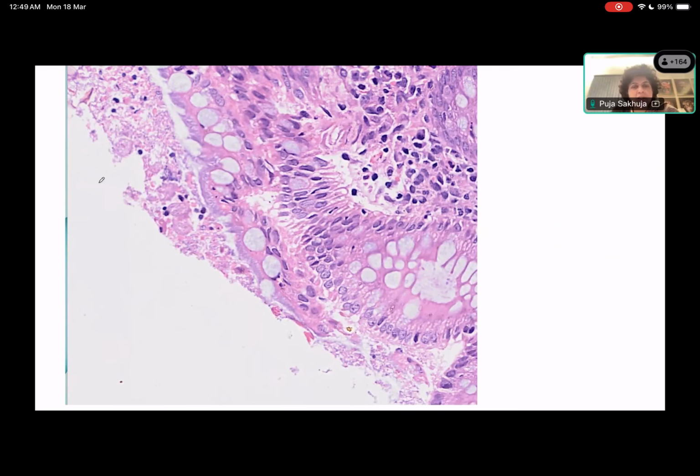Now in this part, do you want to describe something that you are now seeing? Is there anything else visible over here in this high power? Okay, what are these structures? These, where I'm putting a dot, are the amoeba, right? Yeah. Okay. Anything else now? So forget about these Entamoeba histolytica for now. Let's put them in a circle away. Now what else are you seeing here?